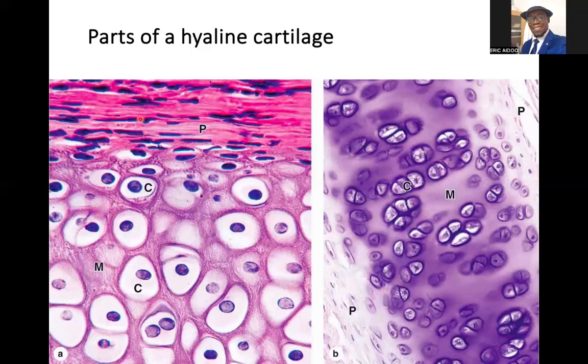So they lay down several chondroblasts on top of each other, so that you end up having them lay down like a mat, or one on top of the other, and then they will start forming the chondroblasts themselves. So these are perichondral chondroblasts, and then these are chondroblasts which have actually emerged from here, and they are also flattened in nature.